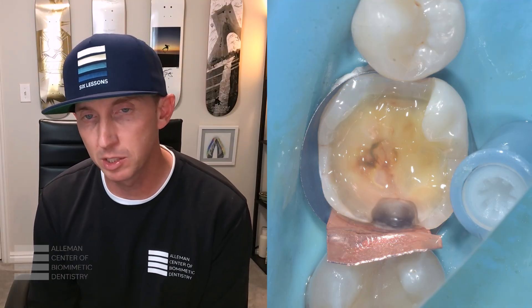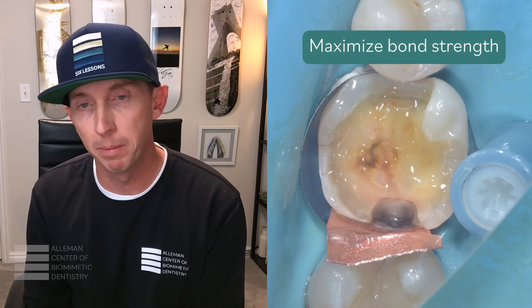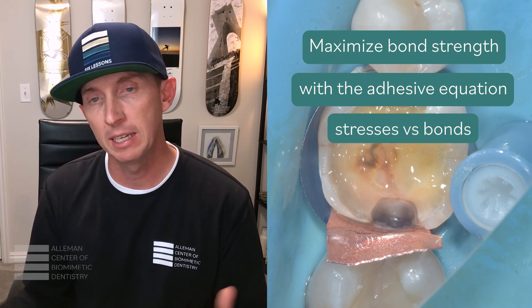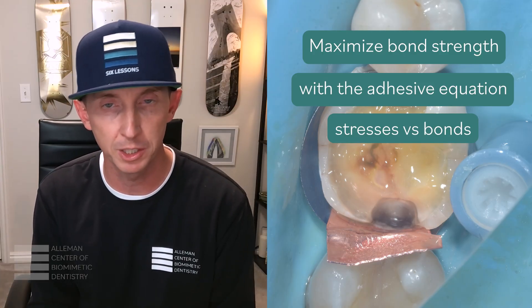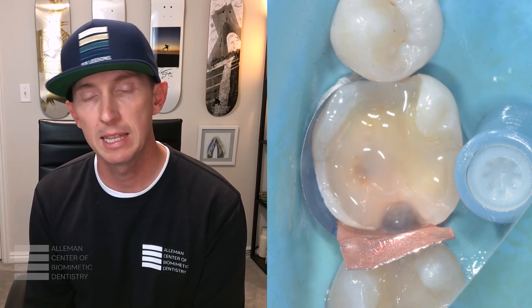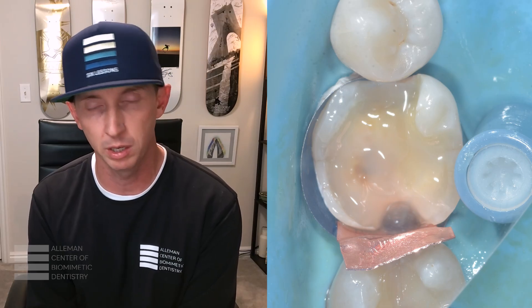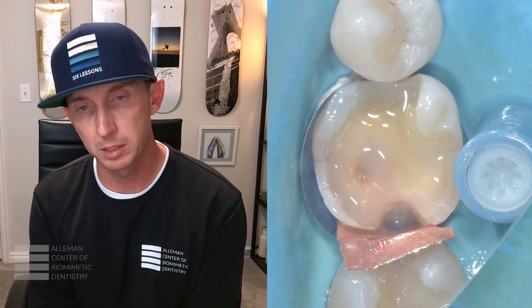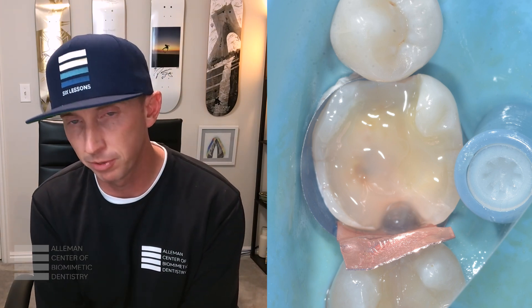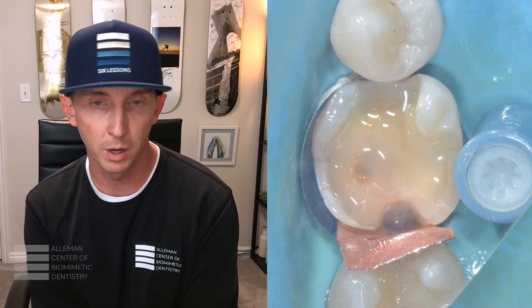This is just bond potential — what manufacturers tell you can be achieved if you switch to their product. To maximize bond strength, we have to understand the adhesive equation, where our bonds are directly in competition with the overlying polymerization stress of our restorative material. As we reinforce our immediate dentin sealing with a resin coat, we need to ensure it is thin. The flowable resin placed on top ensures full polymerization of your adhesive where oxygen inhibition is completely neutralized, and prevents pulpal fluid from entering the bonding field through transudation. The resin coat needs to be thick enough to polymerize, but thin enough to prevent unwanted polymerization stress.